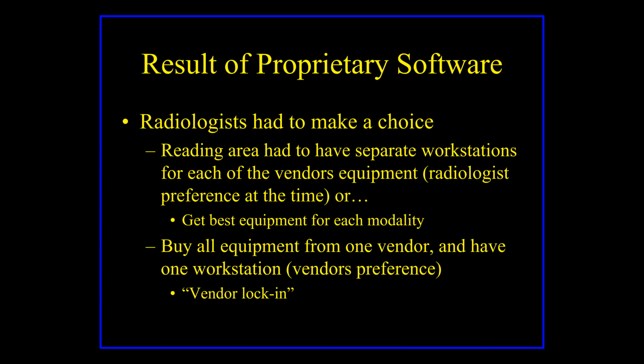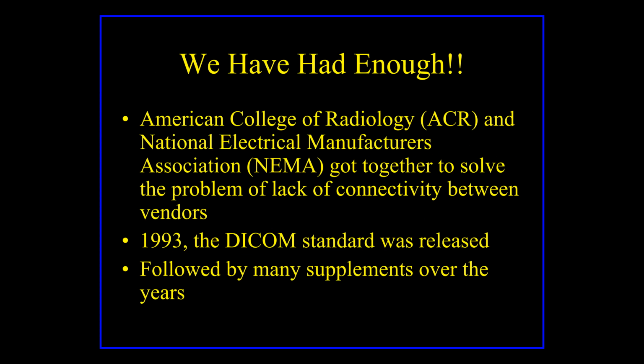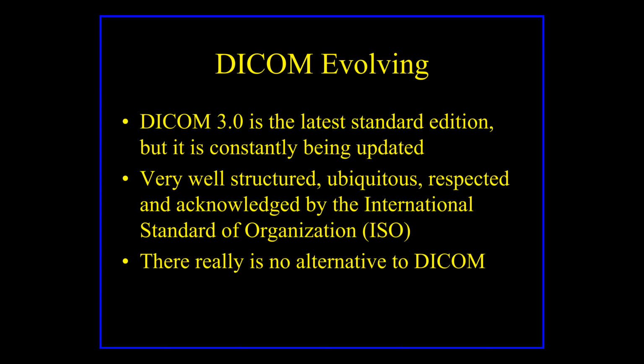So I can look at these images if I have a Mac or if I have a PC. It doesn't have to be made by Philips. It doesn't have to be made by GE. Okay. So finally, the radiologist said, we've had enough. We're not going to put up with that anymore. And y'all are going to conform to this DICOM standard. And eventually all of the vendors had to do that. And that's the way it is now. And so that's really cool. It evolved over time. It got better and better and better.